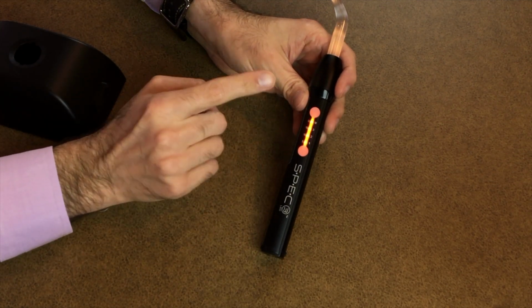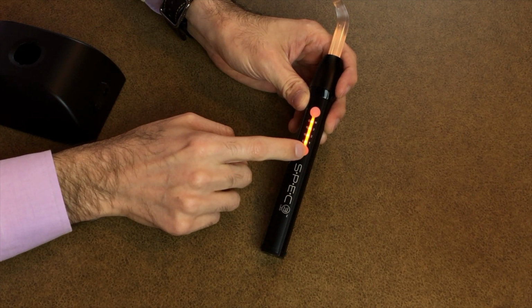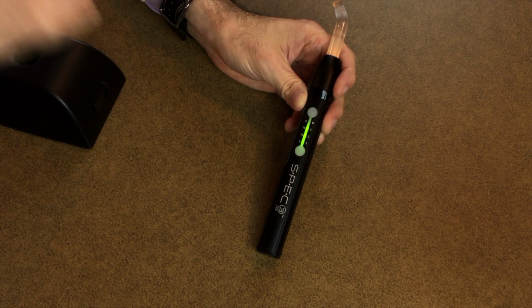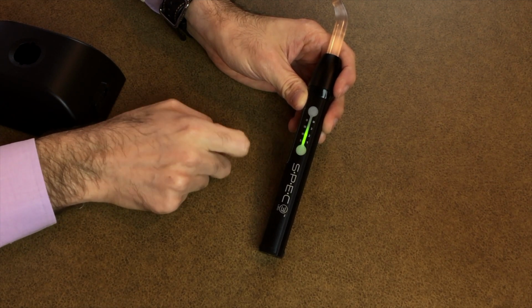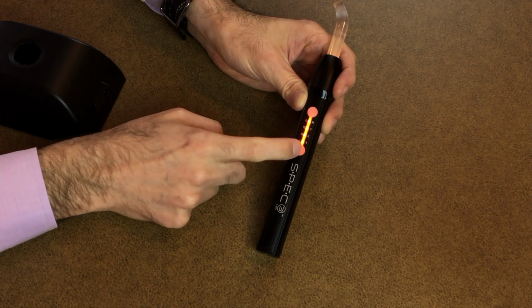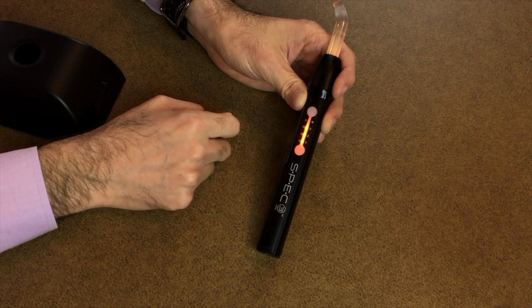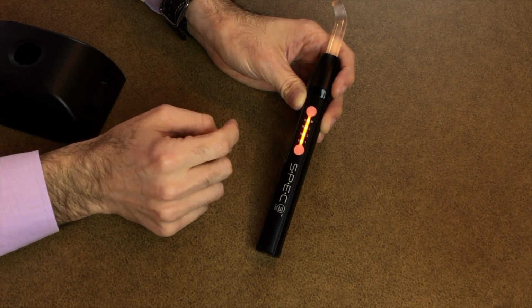So let's talk about modes. So we've got our buttons here. We've got our power button and our cure button, and we've got our modes button. Now, holding the mode button down will switch between standard mode and 3K mode. Standard mode is highlighted in green, and you can press the button again without holding it to go from 5 to 10 to 15 seconds. And you can just keep cycling through those. Again, I'll hold it down, and then I can cycle in 3K mode 1, 2, or 3-second cure times. Press it one more time, and that takes me to the third mode, which is ortho mode.